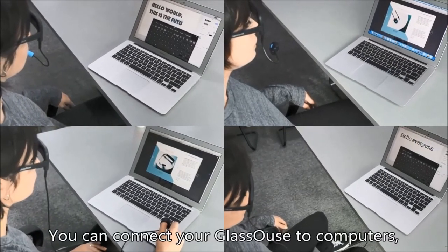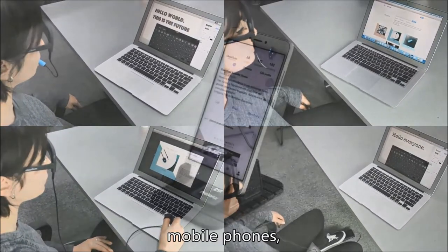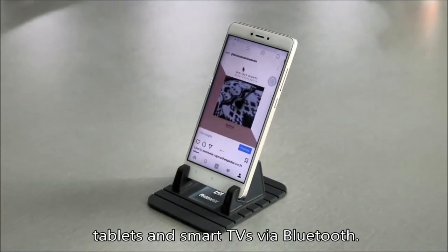You can connect your GlassOuse to computers, mobile phones, tablets, and smart TVs via Bluetooth.